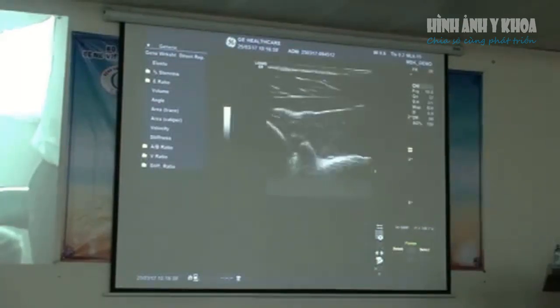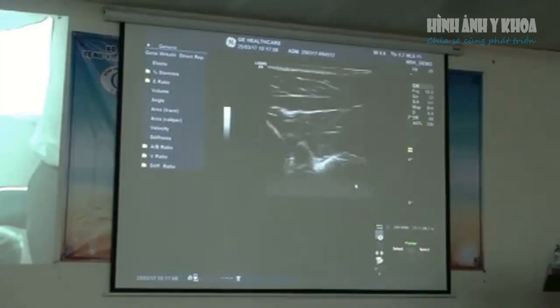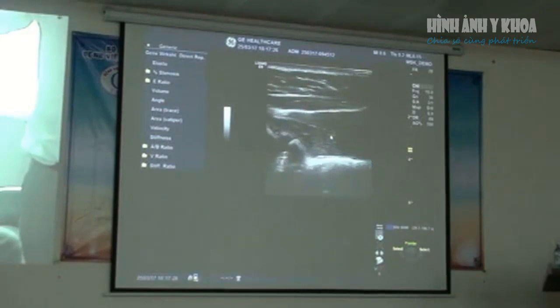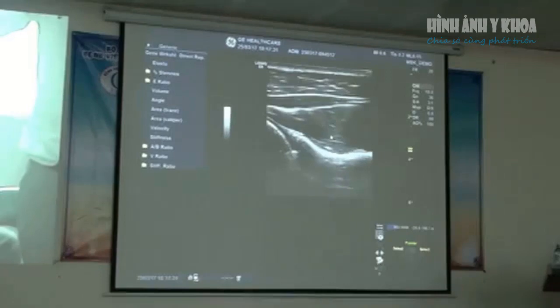So in this area, in the setting of labral tears, we can get ganglia that push into this area. Mình sẽ khảo sát bệnh lý là các sụn viền sau hoặc là những cái khối choán chỗ chèn ép của mạch thần kinh trên gai như là nang. And it causes neural compression on that nerve. Mấy cái nang ganglia nó sẽ gây chèn ép vô cái đoạn thần kinh trên gai. And that nerve supplies the infraspinatus muscle. Cái thần kinh trên gai này sẽ chi phối cho cái cơ dưới gai. And also the supraspinatus muscle. Và đôi khi cũng chi phối cho cơ trên gai luôn.